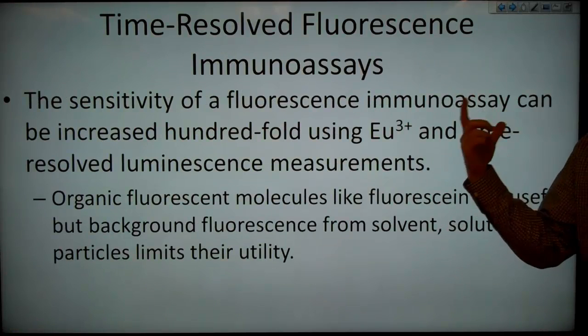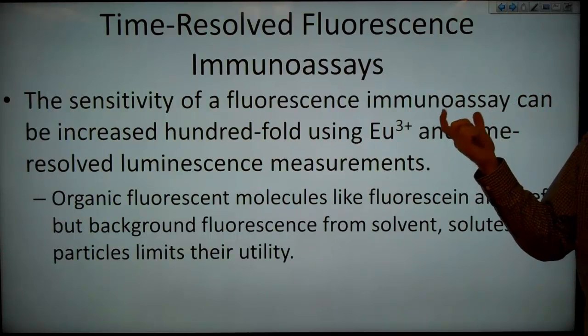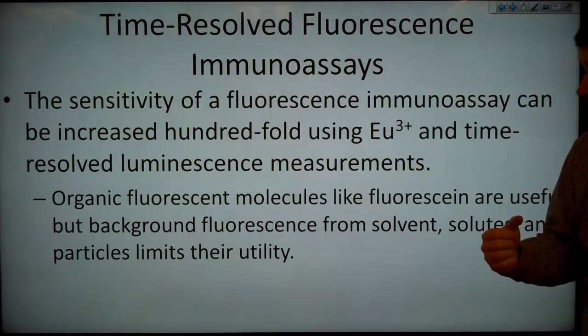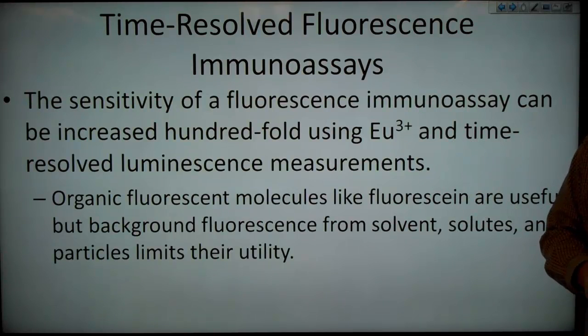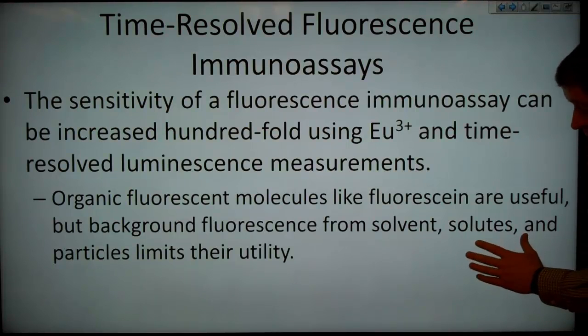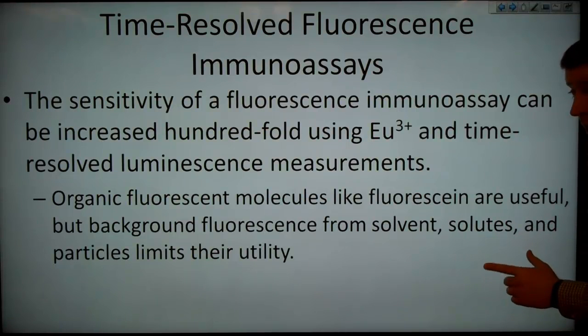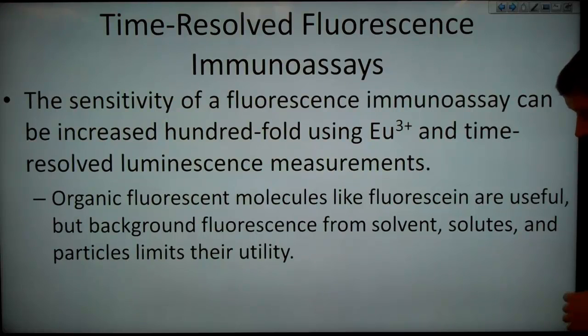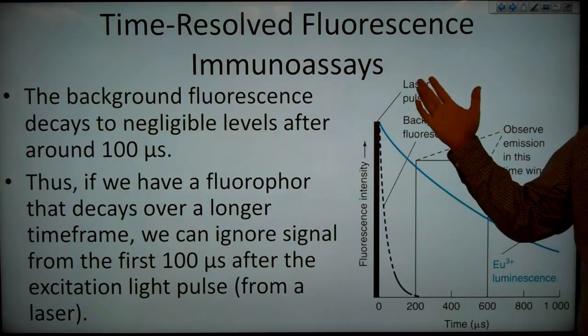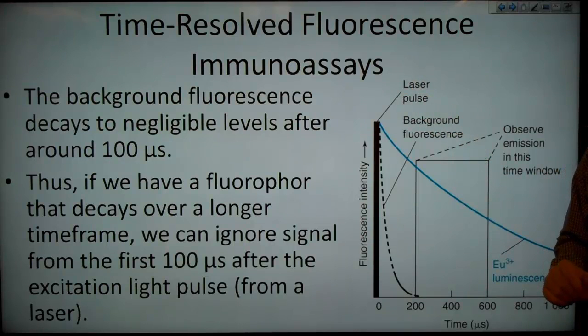The sensitivity of a fluorescence immunoassay can be increased 100-fold using europium-3+ and time-resolved luminescence measurements. Organic fluorescent molecules like fluorescein are useful, but the background fluorescence from solvent, solutes, and particles can limit their utility. The background fluorescence decays to negligible levels after about 100 microseconds.